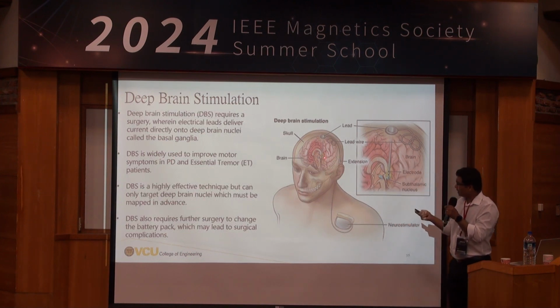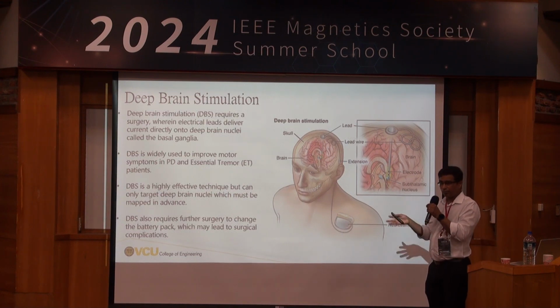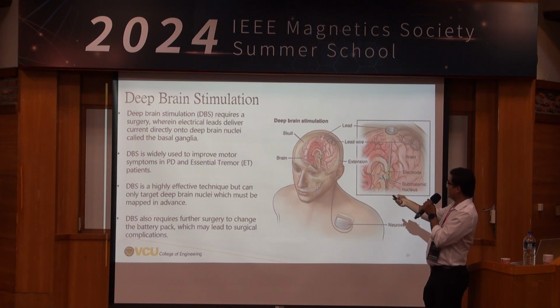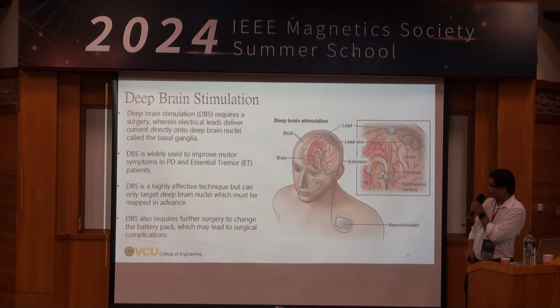So they use these deep brain stimulators to stimulate the STN area, which balances the motor pathway network and reduces the tremor immediately. So this is done by surgery with this lead, and here is a power unit that continuously sends a small current, and this needs to be charged regularly. So this is a well-established technique.